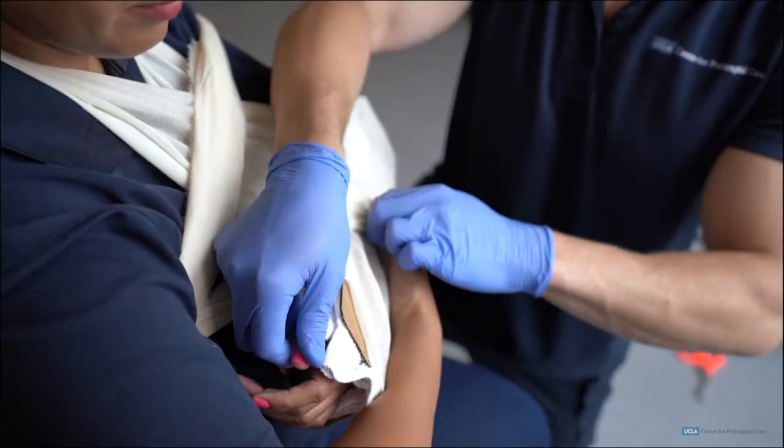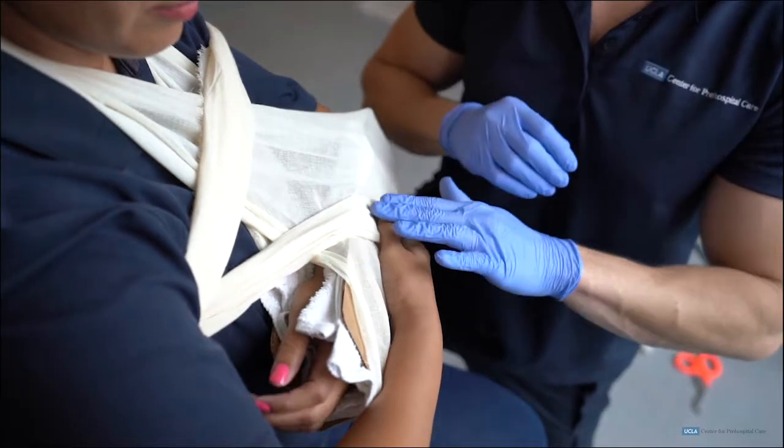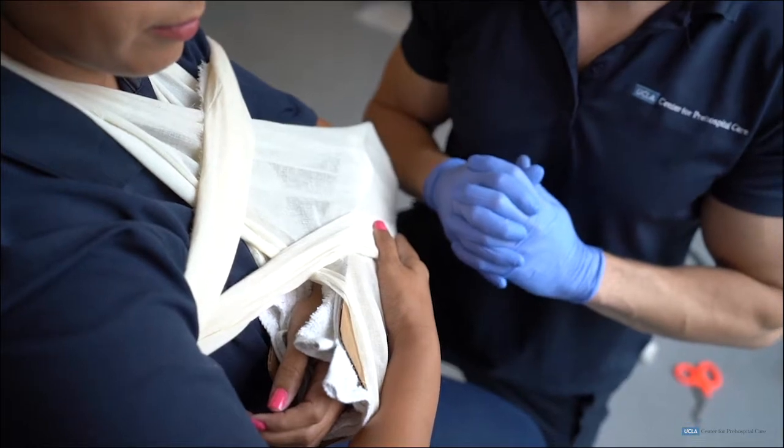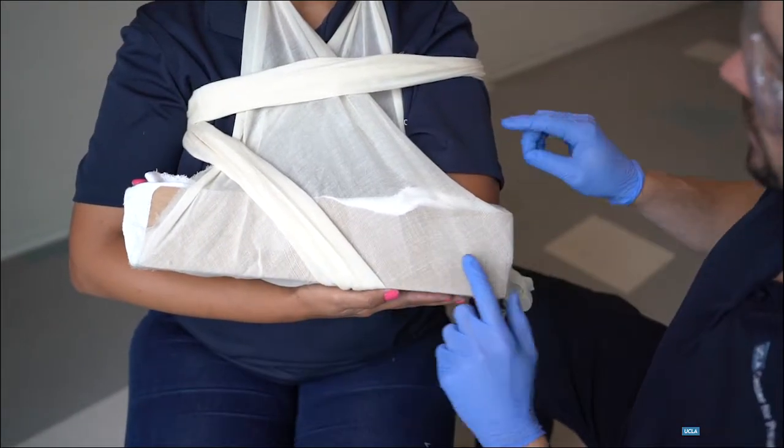Before splinting is complete, the EMT will ensure circulation, motor function, and sensation distal to the injury are present. Proper immobilization can prevent tissue damage and provide pain relief to the patient.